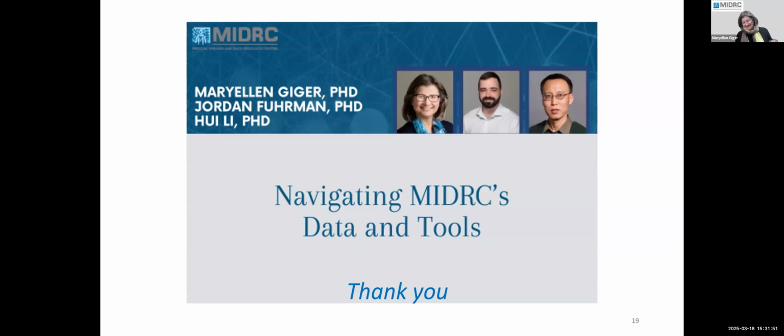Go ahead, Jordan. Well, I guess if the question's about curation of the metadata, for example, prior to use in the stratified sampling or React tools, depending on how your data is organized, you may need to do some reorganization. For example, I showed that table during the talk, which maybe I can pull up again.